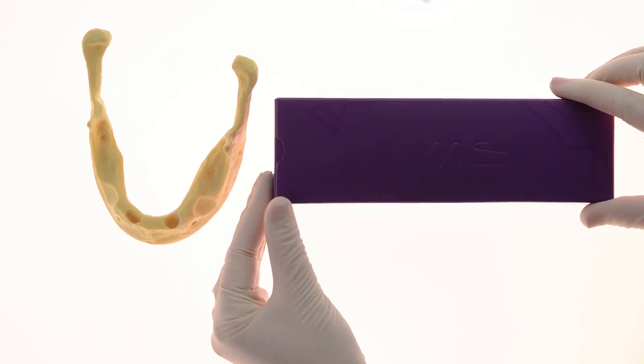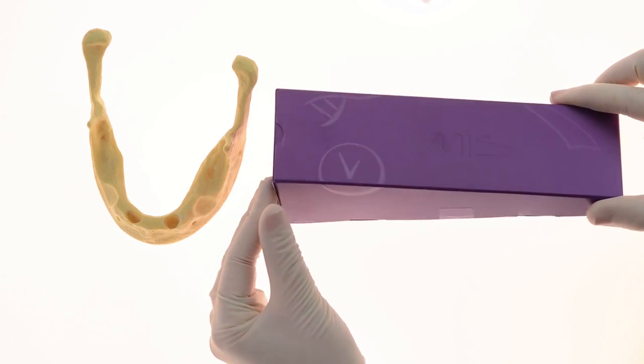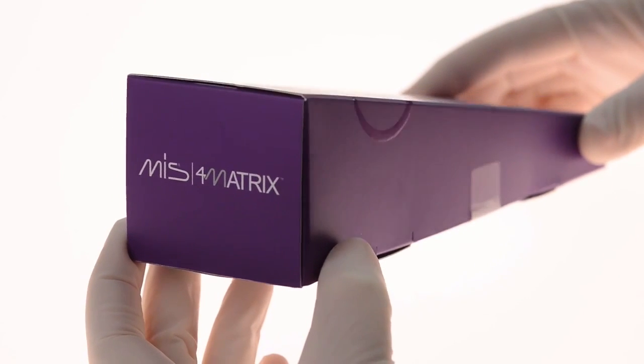The product is composed of biphasic calcium sulfate and hydroxyapatite, and is characterized by a predetermined setting time and resorption rate.